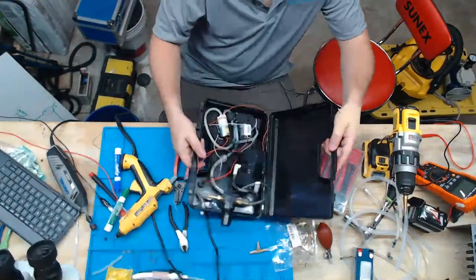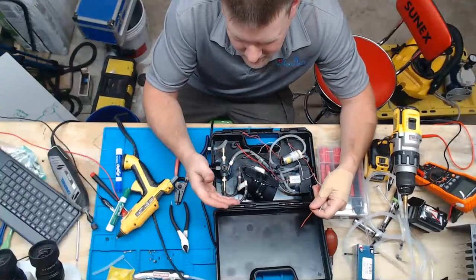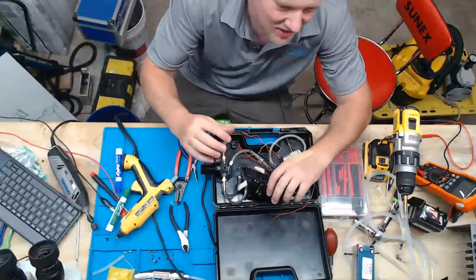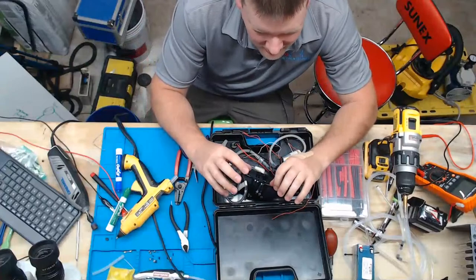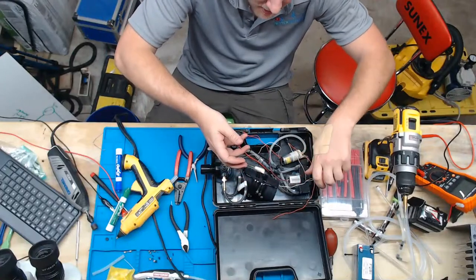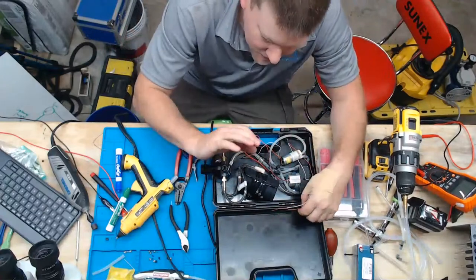And it seems like such a simple solution that you would think that somebody out there would have already made this device. Because there are a series of devices where we have to output a very specific air pressure to calibrate the device. And a lot of times guys will use a syringe and it's cumbersome and it takes forever to do. I mean, it's very accurate. Some of those calibration syringes, you screw the plunger in and then it holds, but then you got a little petcock valve, you close it off, you open the syringe back up. If you need more pressure, close that, open that, and you squeeze it back down till you reach your pressure that is desired. No more of that, guys.